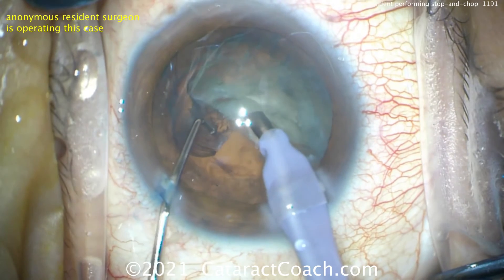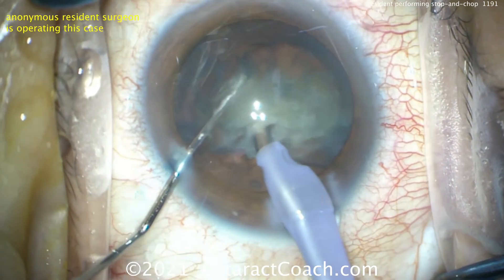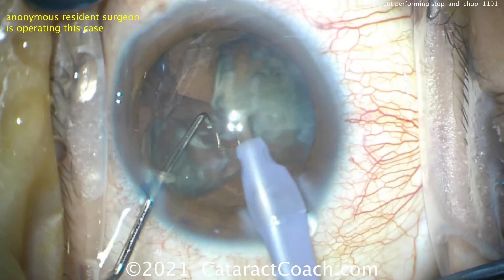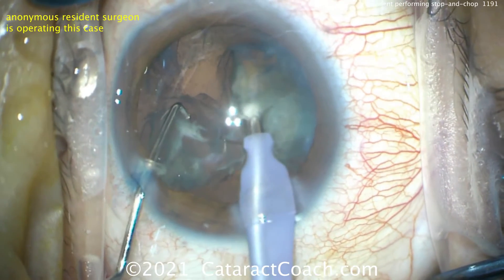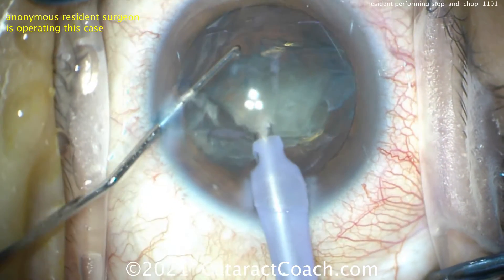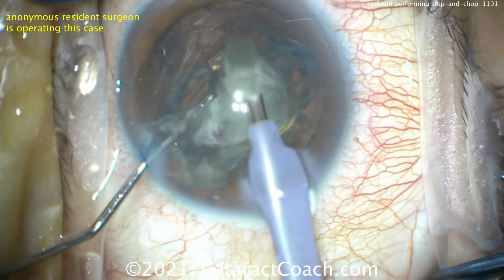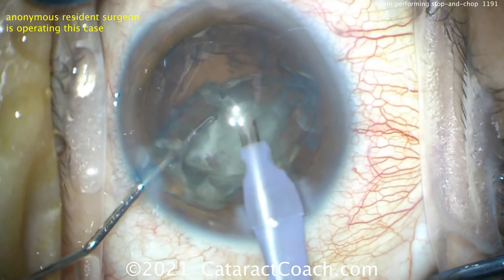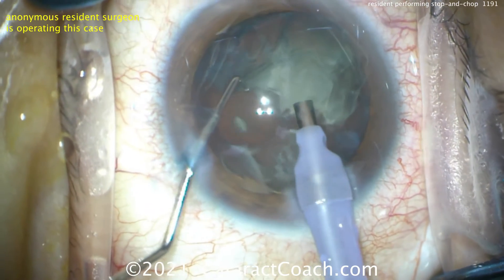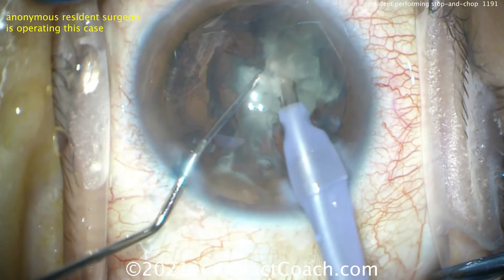This is definitely a technique you want to master. Every resident who works hard enough should be able to do a nice stop-and-chop by end of residency — something of this level around case 200 to 300. After chopping one piece, you don't necessarily have to remove it — you can sub-chop into more small pieces. When the chop is slightly incomplete, it's because you probably lost vacuum. There's a window in which you have only a little time to chop when vacuum is high. Buzzing in again — now chop — that'll be a clean chop for sure. Good split.